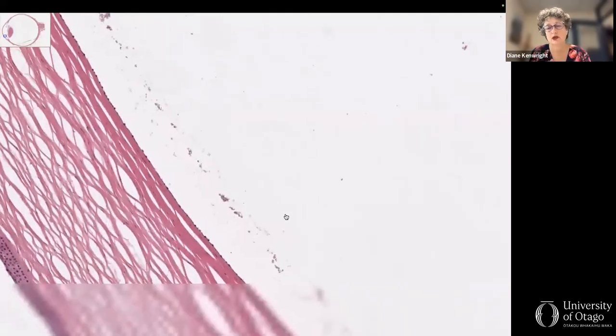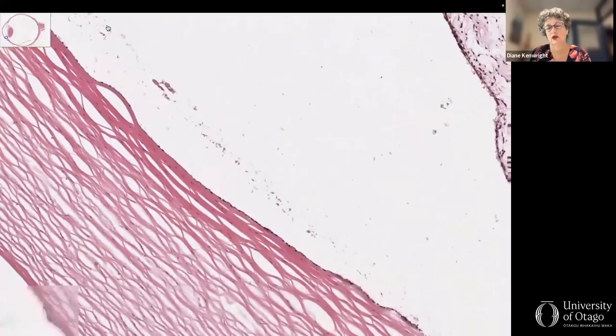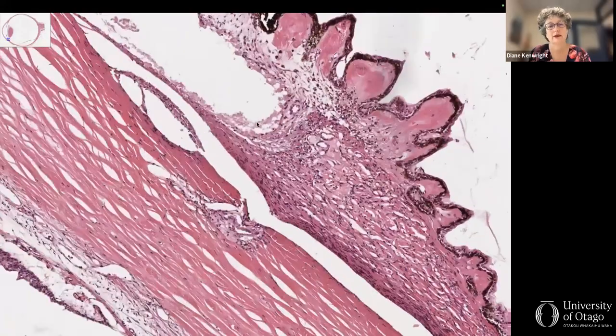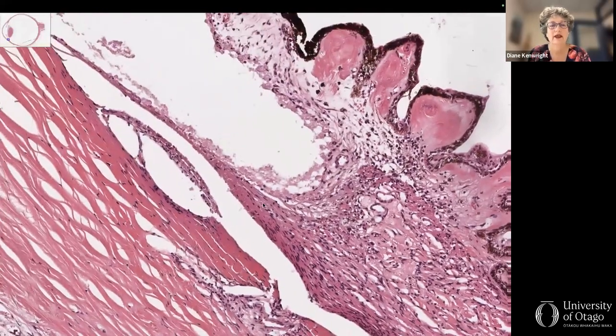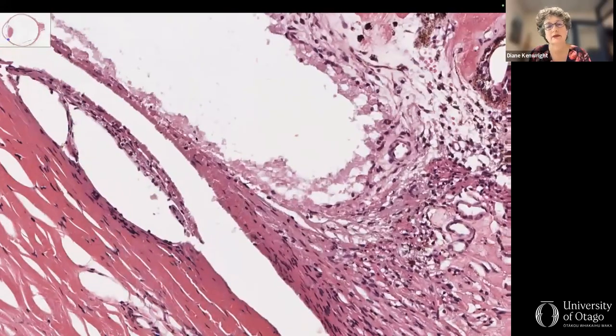Let's move back to the trabecular meshwork here. See, the fluffy debris goes all the way around here. All right, so let's examine more closely what's happening here. We've got the trabecular meshwork, canal of Schlemm, and then we can see here in the angle and on the anterior iris some macrophages. You can see the nuclei here and this proteinaceous debris.